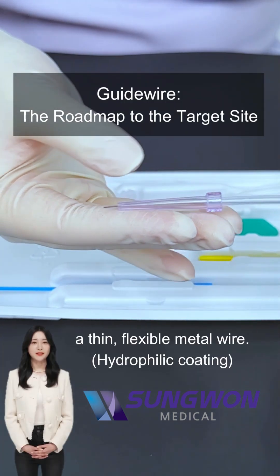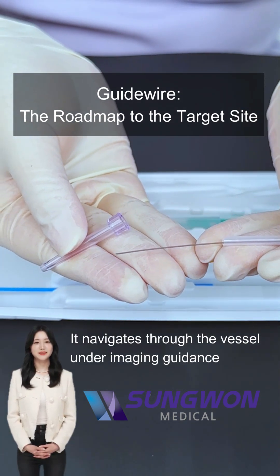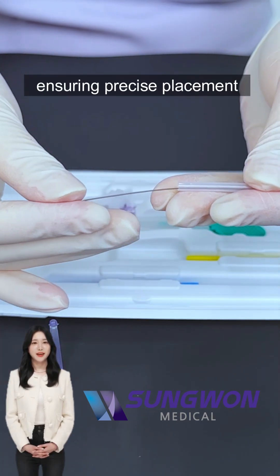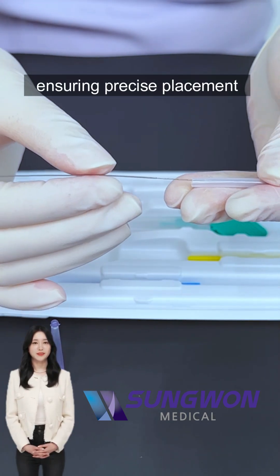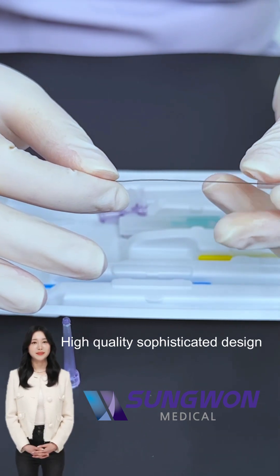The guide wire is a thin, flexible metal wire. It navigates through the vessel under imaging guidance. Other devices, like catheters, follow along this wire, ensuring precise placement and minimizing vessel damage.